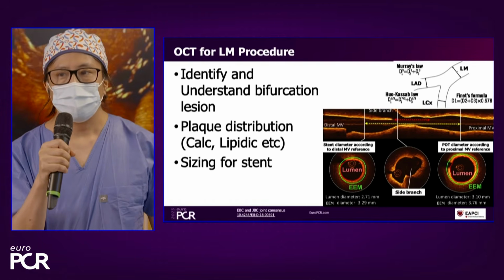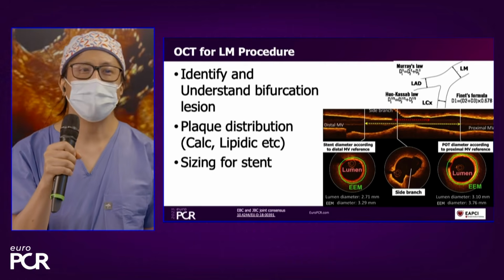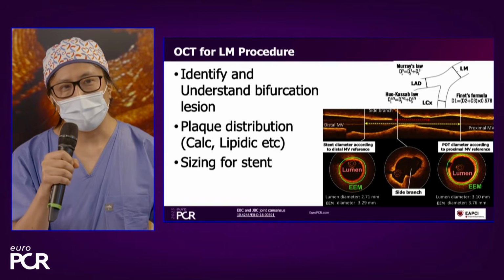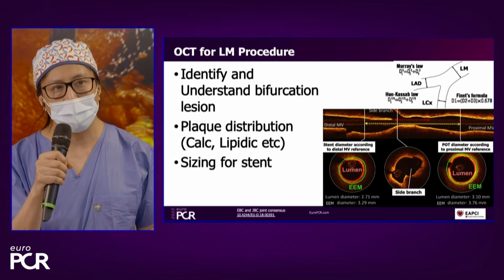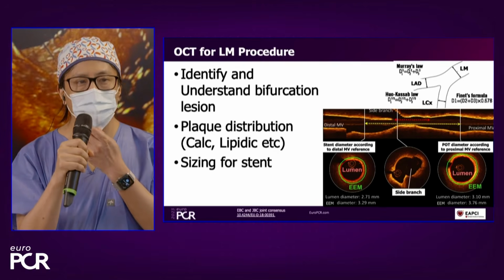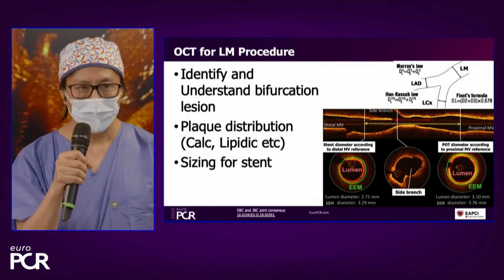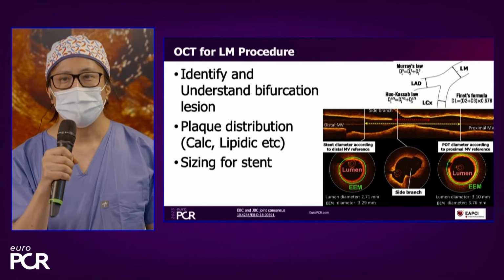Fine. And that would lead on just to the next question, which is, should there be a battle between IVUS and OCT? Is one better than the other, or can we use both? I think we can use both, and the absolute solution would be the combined catheter, where you can use both technologies at the same time, so that you can see the plaque with the IVUS and precise measurement of lumen by the OFDI.